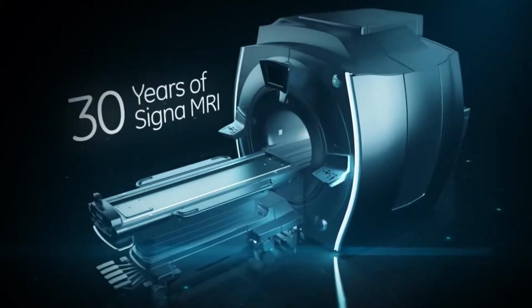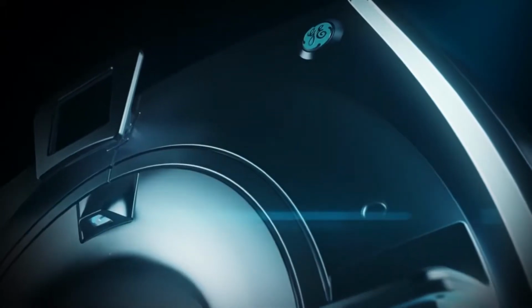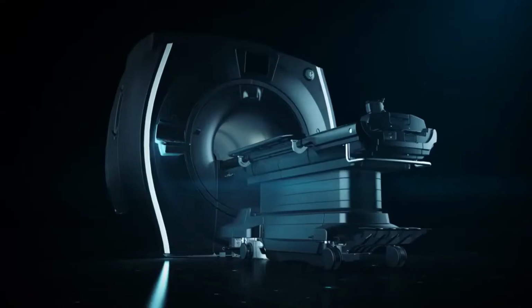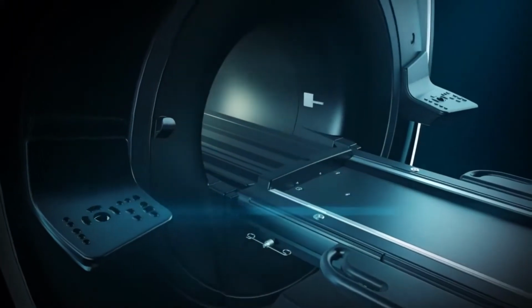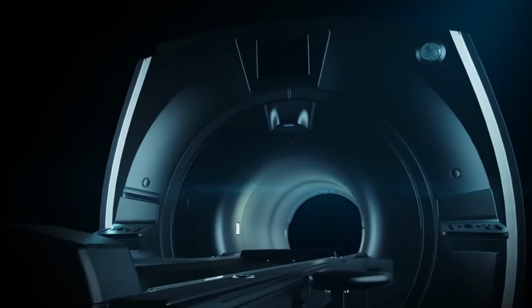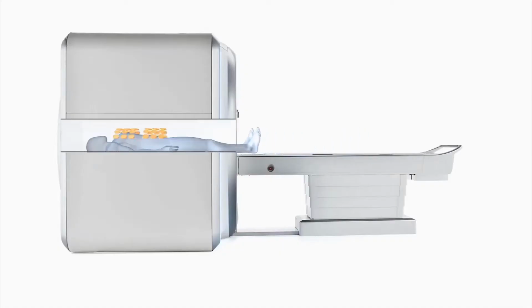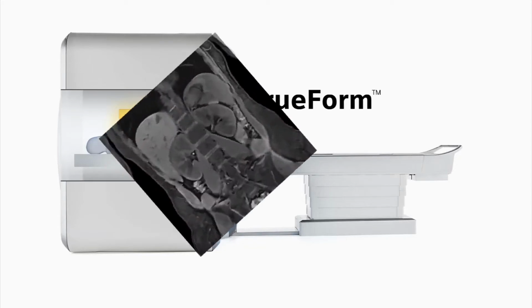Let's begin with the components of MRI machines. The major components of an MRI scanner are the main magnet, which polarizes the sample, the shim coils for correcting the inhomogeneities in the main magnetic field, the gradient system, which is used to localize the MR signal, and the RF system, which excites the sample and detects the resulting NMR signal. The whole system is controlled by one or more computers.